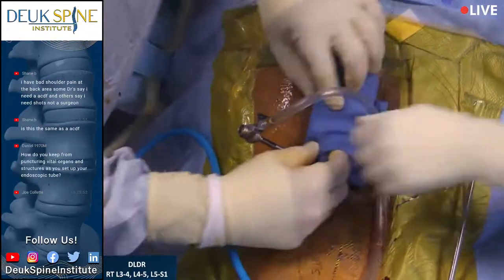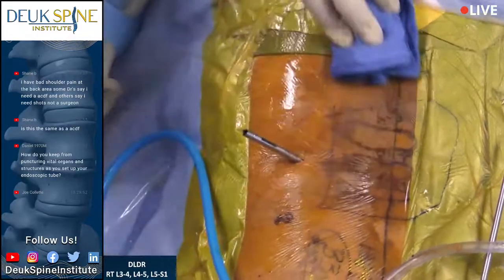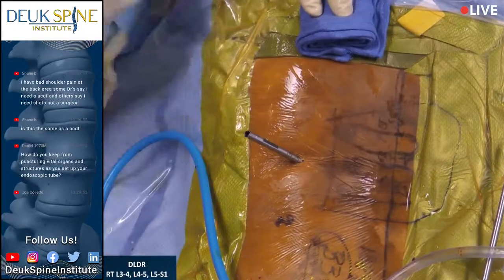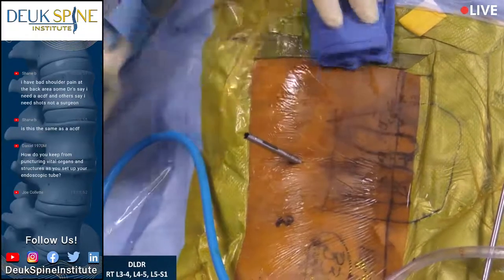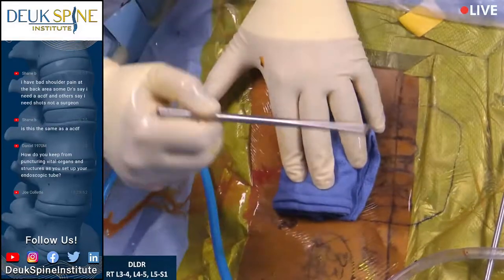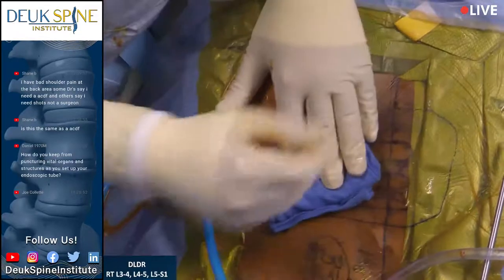Okay, let's just show our audience. Can you see this, Flynn? Yeah, the whole surgery was done through this little tube, three discs. I just redirected it each time. And you guys can see the tube here. It's literally like a little shake straw, you know?